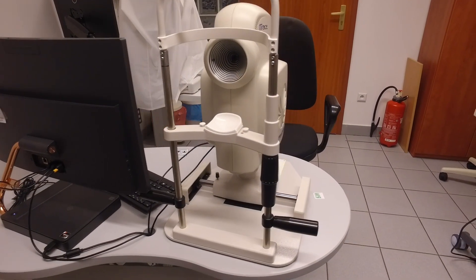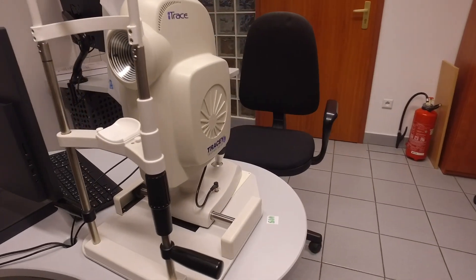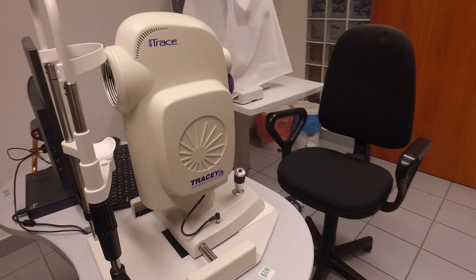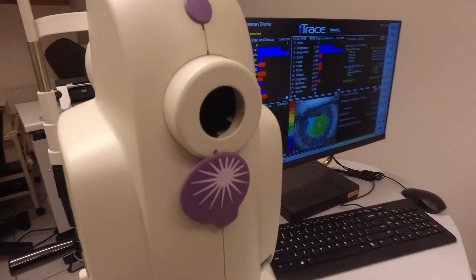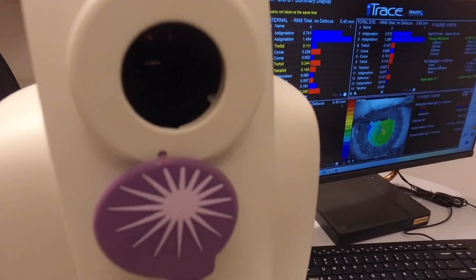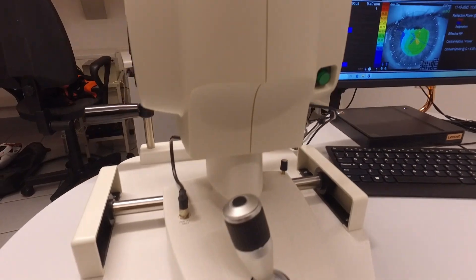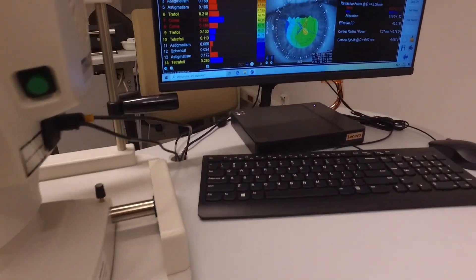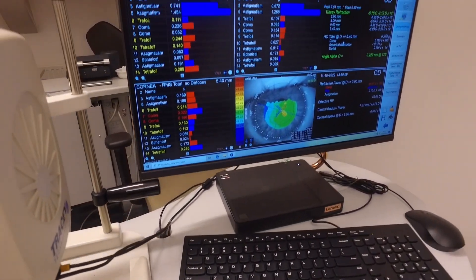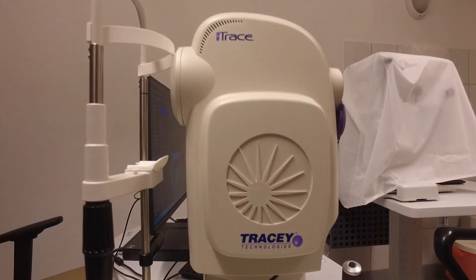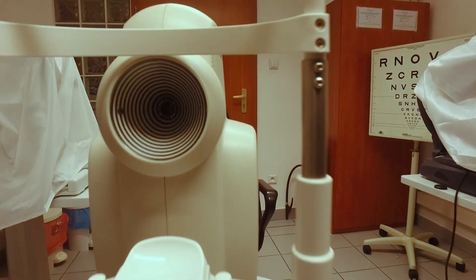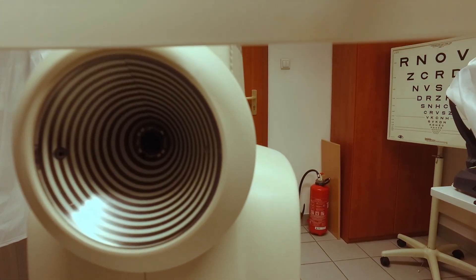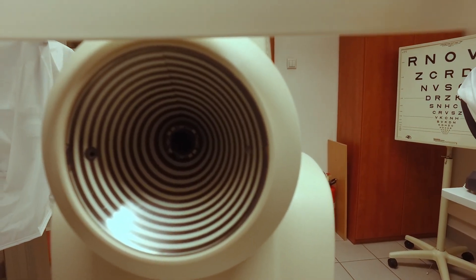This is how the machine looks from the outside. There are handles for keeping the hands of the patient. At the back there is a hole that the patient has to fixate through so that they're relaxed. The operation of the machine is via joystick. There's a computer screen and Placido rings in the front.